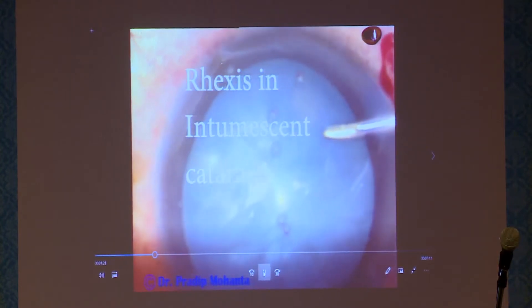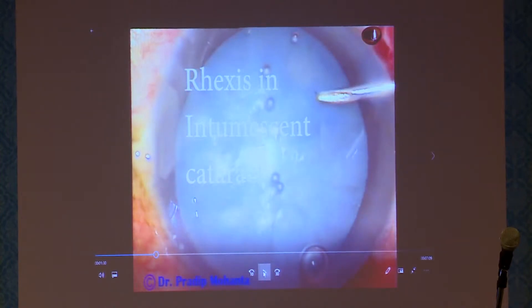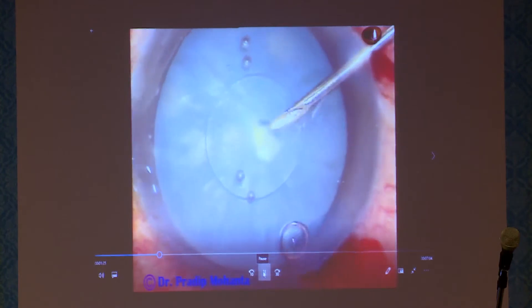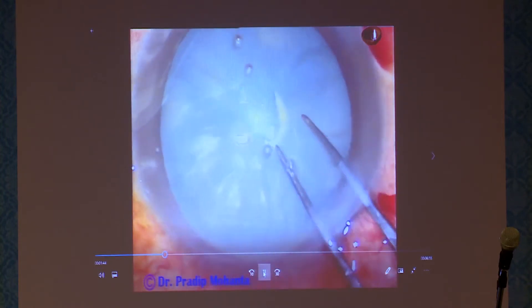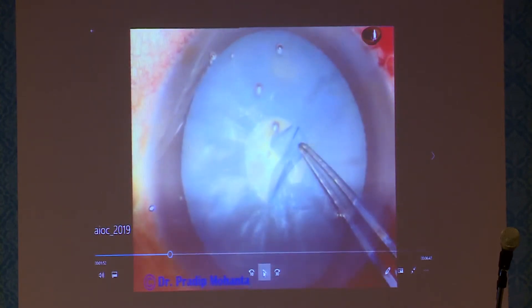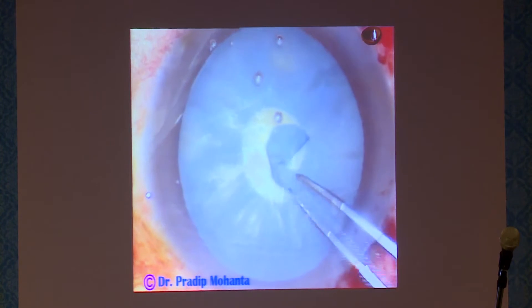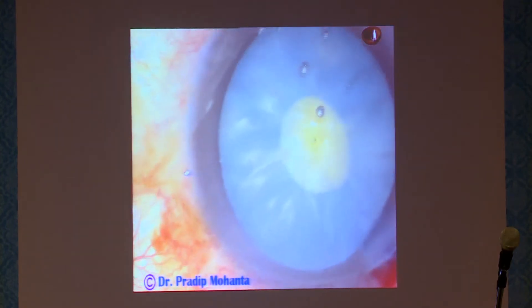Now we come to intumescent cataracts. These cataracts can be soft or hard. The main thing is the rhexis. As you make a puncture, there is leakage of oily or turbid fluid. Convert this puncture into a C-flap first, then use utrata forceps to make a small flap. It tends to go to the periphery, but since you have aimed a small rhexis, you have enough margin of safety and can bring it back. In these cases, I always use hydroxypropylmethylcellulose and nothing else.